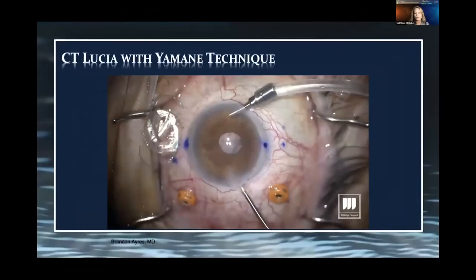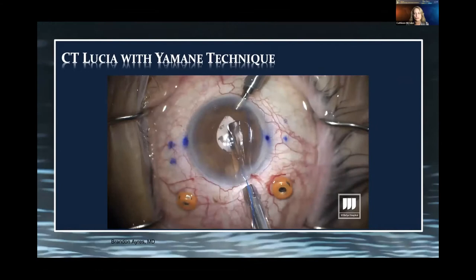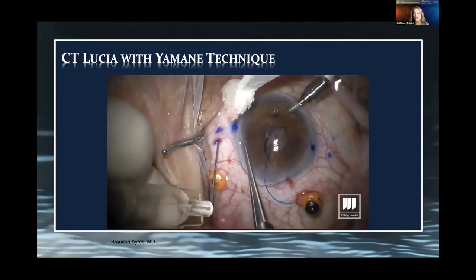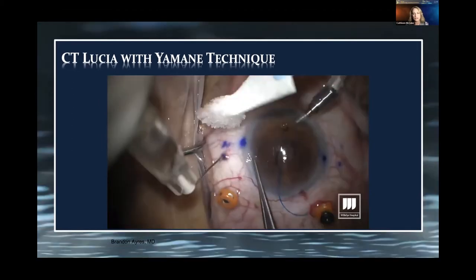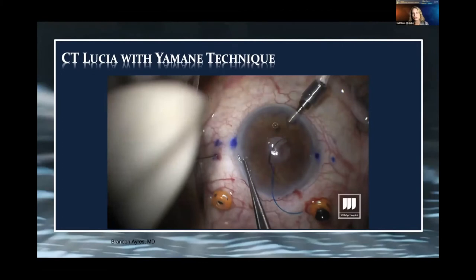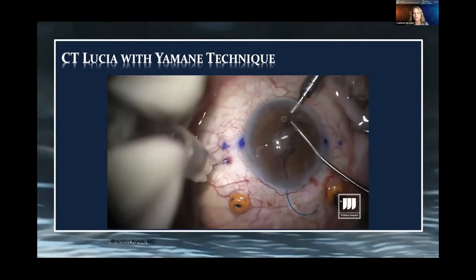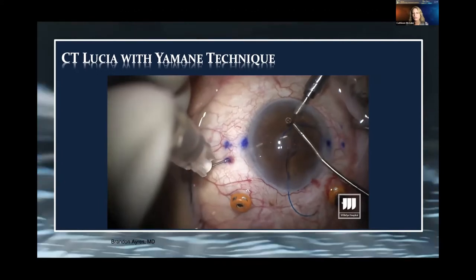It's a minimally invasive way — we don't have to take down conjunctiva. This is Brandon Ayer's video demonstrating insertion of the CT Lucia lens after removing another IOL and doing an anterior vitrectomy. You can see marks on the conjunctiva 2 millimeters posterior to the limbus, then he creates a 2-millimeter tunnel with the 30-gauge TSK needle — a partial thickness scleral pass, turning at the 2-millimeter mark and entering the posterior chamber. Using intraocular microforceps, he grasps the leading haptic and introduces it into the bevel of the needle. There can be some variability in needles, so try this ahead of time to make sure the haptic fits.